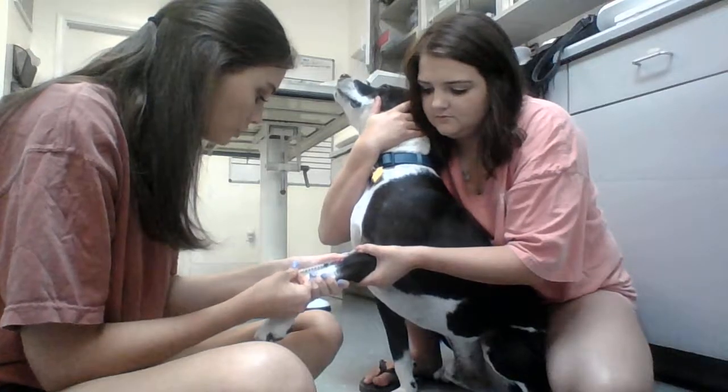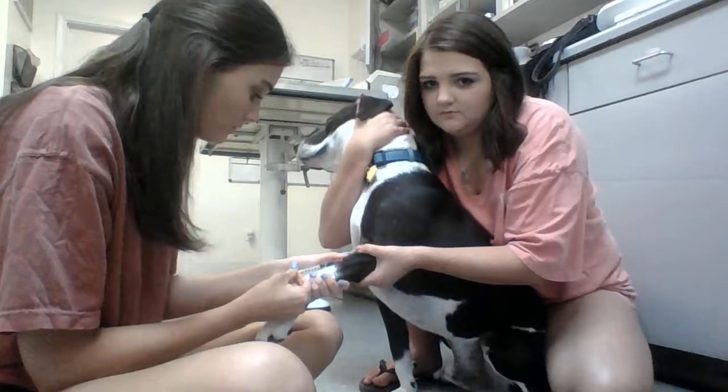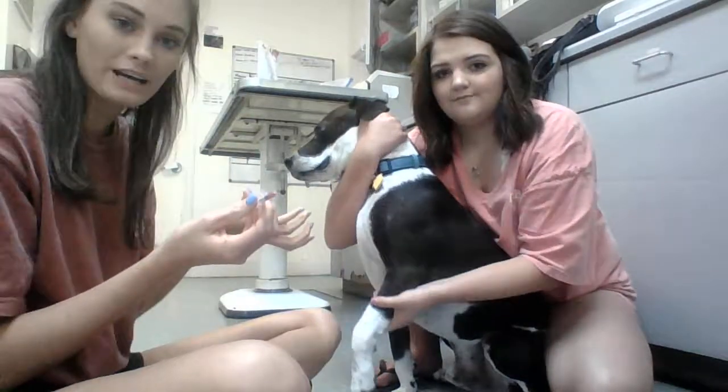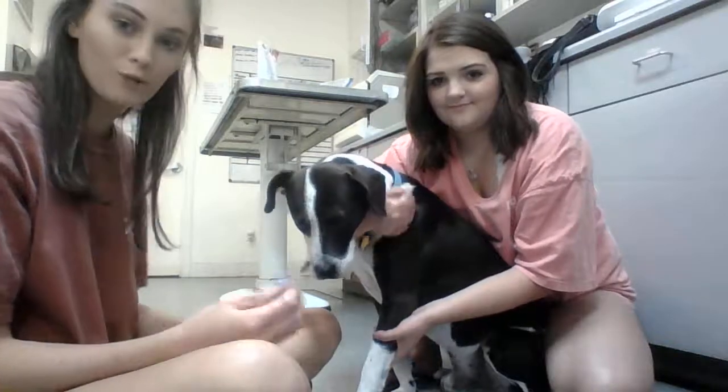Then I pull back on my plunger to break the seal. Once I get blood, I ask my restrainer to hold off to obtain hemostasis, and that's how you draw blood.